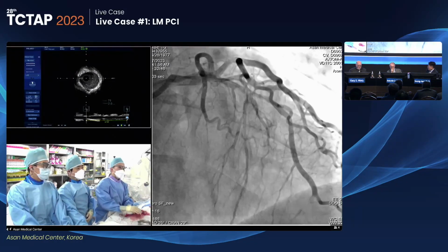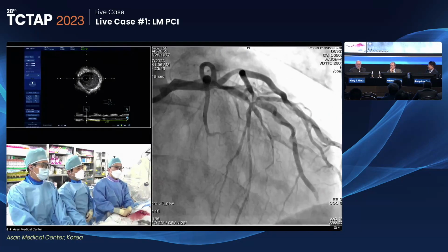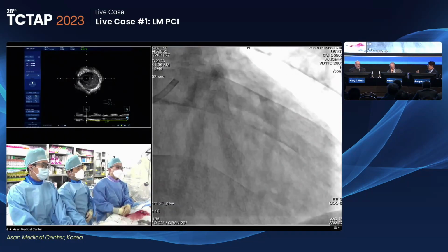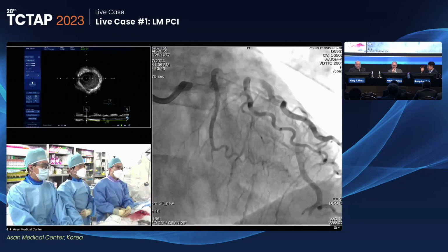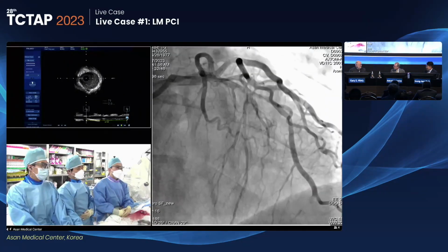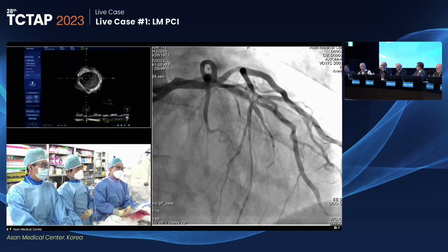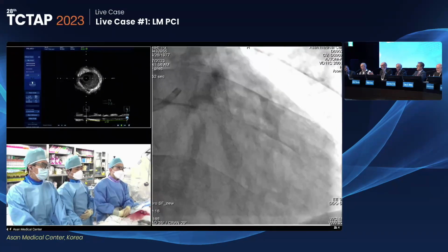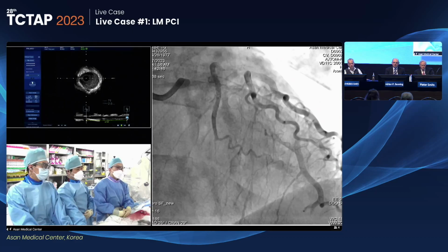A 48 millimeter long stent, is it okay? I mean, in this case, I agree with it. Lengthwise 50, and I would say effective stent area at least 5. Do you agree with that one? No. The key thing is to make sure that the vessel stent is tapered to the natural anatomy. That you don't try and produce a tube which is the same diameter at the ostium as it is at the distal end. So we size the distal vessel, we cover it all, and then we inflate it sequentially to match the natural size of the vessel.